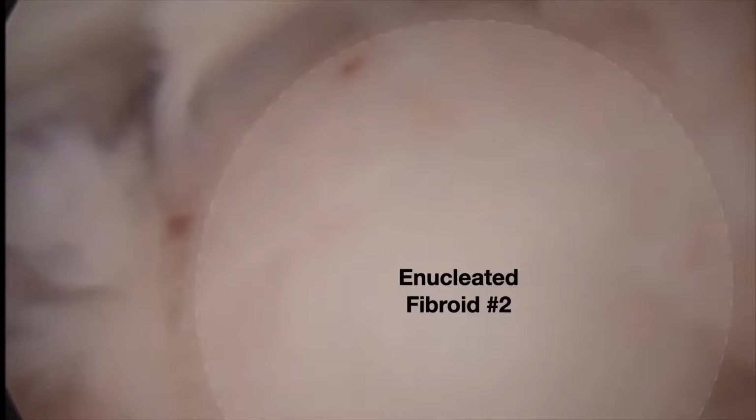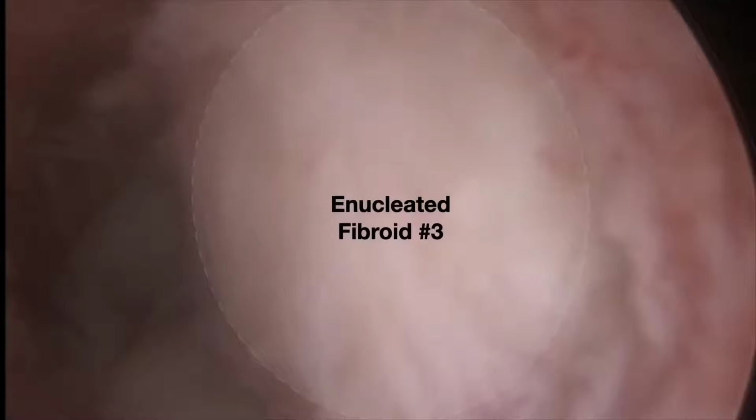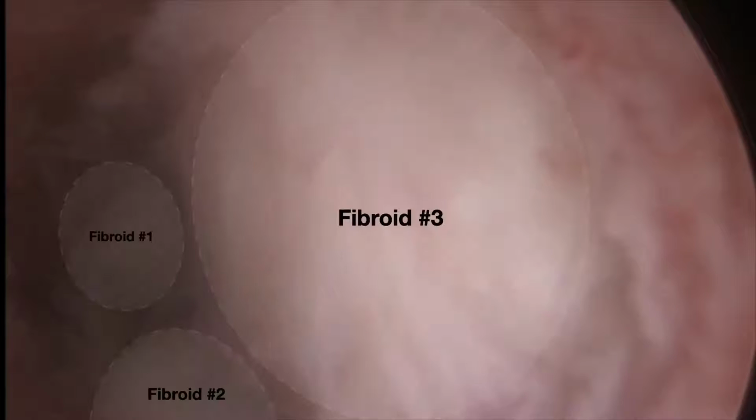All fibroids must be enucleated before cervical dilation is performed. Otherwise, distension of the uterine cavity wouldn't be optimal due to transcervical fluid loss. Visualization would be poor, and the enucleation maneuver would become technically difficult. All 3 submucosal fibroids were successfully enucleated without detaching them from the fibroid fovea. Now, they are ready for complete fibroid extraction.